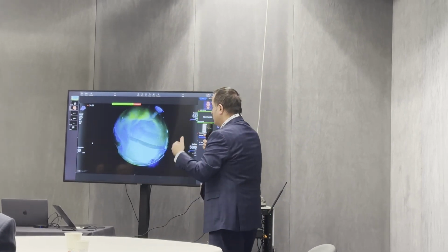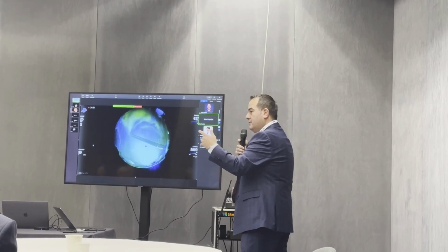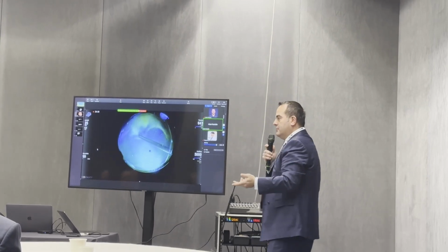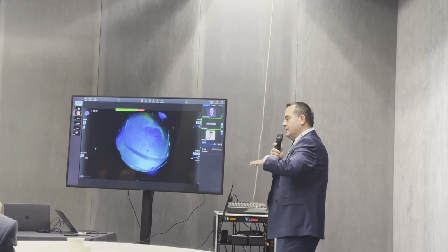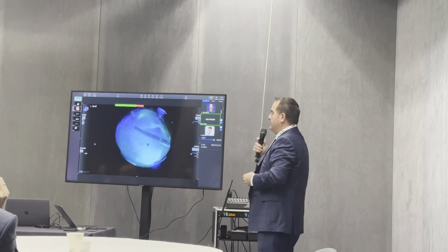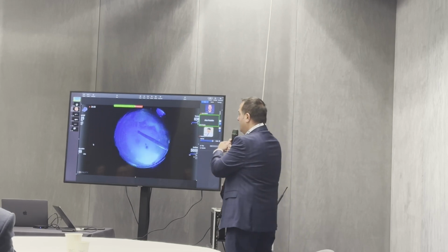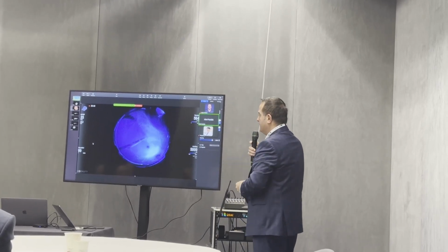And that is why yesterday I said that the Ingenuity provides us with the ability to see the invisible, which is a bit of a, let's say, tease to the audience, but the vitreous is mostly invisible, and sometimes with playing with the light, we might highlight certain areas of the vitreous. So, do you agree that there is a lot of vitreous remnant in that eye after the staining with the, let's say, classic approach of staining?